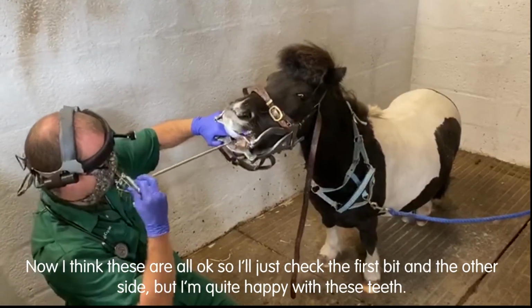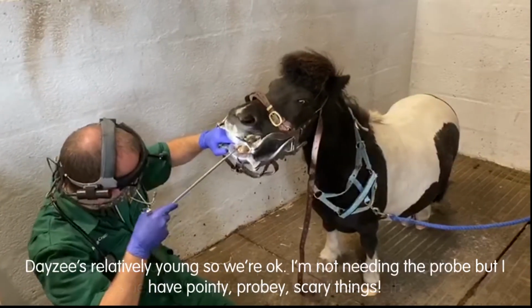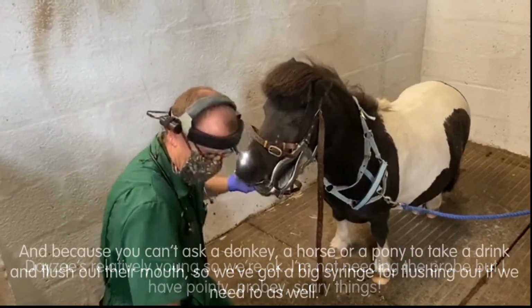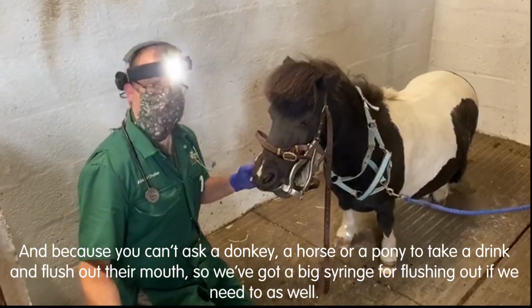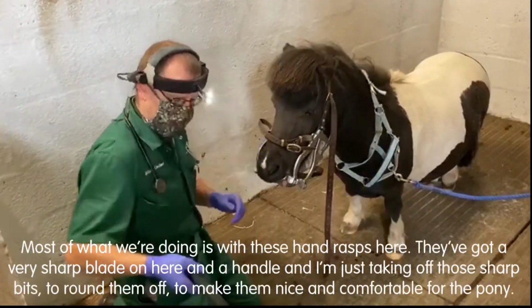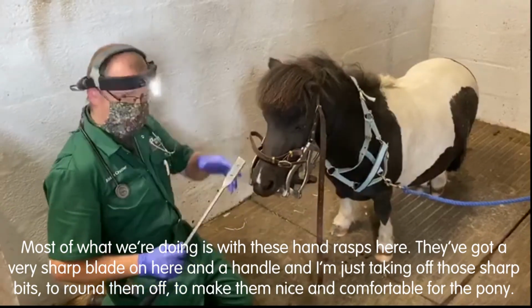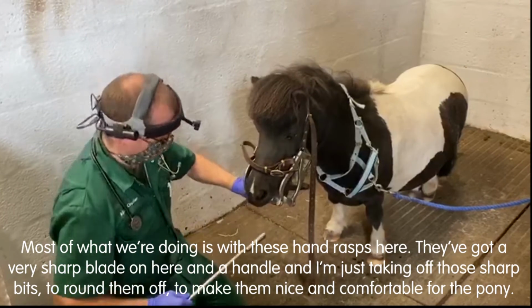Now, I think these are all okay. So I'll just check the first bit on the other side, but I'm quite happy with these teeth. Daisy's relatively young, so we're okay. I'm not needing to probe, but I have pointy, proby, scary things. And because you can't ask the horse or donkey or pony to take a drink and flush out their mouth, we've got a big syringe for flushing out if we need to as well. But most of what we're doing is with these hand rasps there. They've got a very sharp blade on here and the handle, and I'm just taking off those sharp bits just to round them off, just to make them nice and comfortable for the pony.